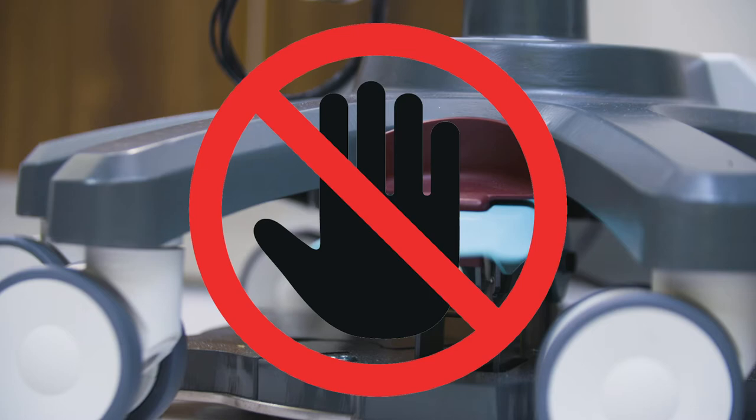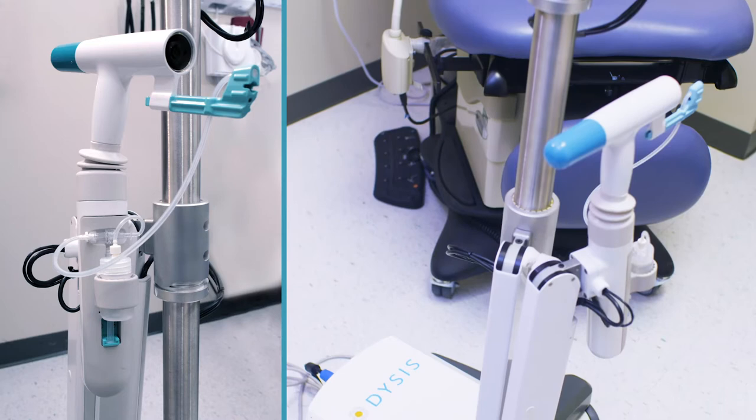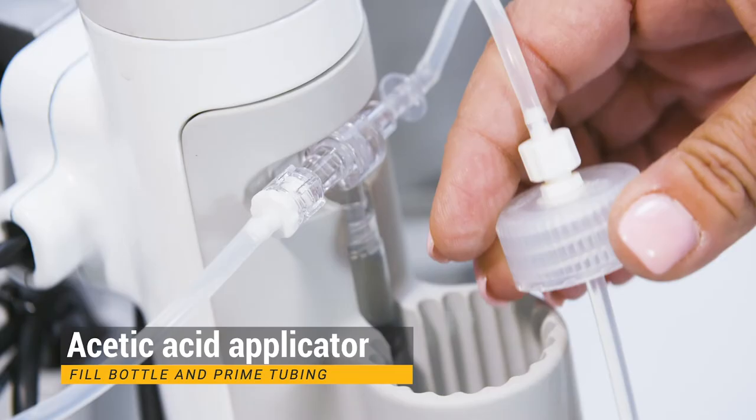The Acetic Acid Applicator is located on the side of the imaging head. To fill the Acetic Acid Bottle, remove the bottle from the holder, unscrew it from the cap, fill, and place back into the holder.